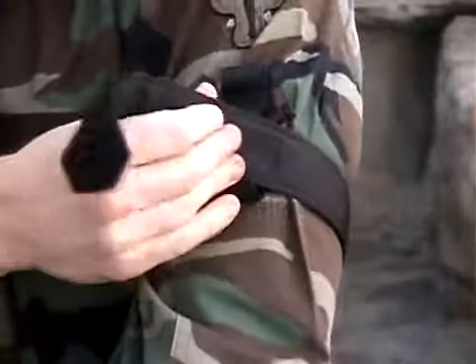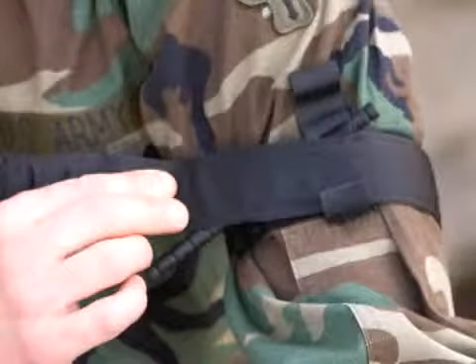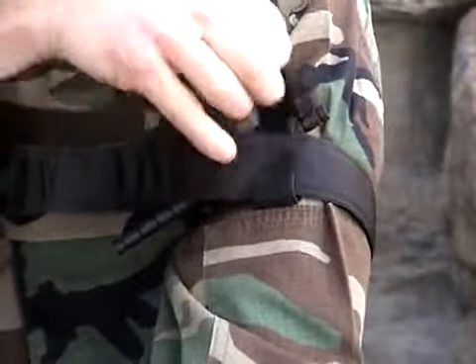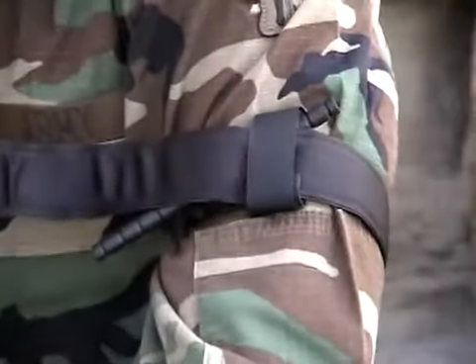Before moving the patient, continue to adhere the self adhering band around the extremity through the windlass clip and over the windlass rod. Grasp the windlass strap, pull it tight, and adhere it to the hook on the windlass clip.